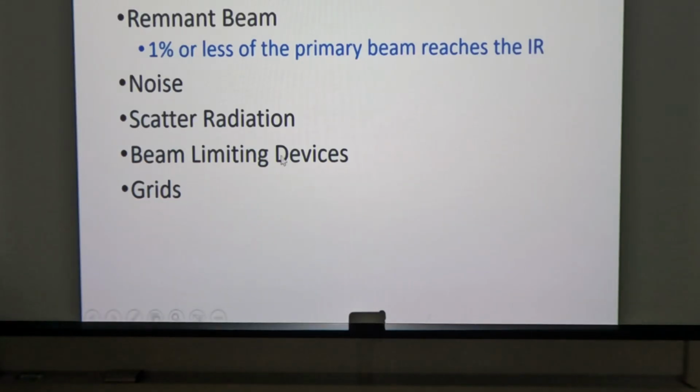Beam limiting devices are going to be, again, your collimators. We talked about two sets of collimators, one on top and one on bottom. The ones on top were specific for limiting off-focus radiation. The ones on bottom are the shutters that you actually see whenever you collimate, you open and close your collimation. Those are the ones that limit your light field and therefore limit your radiation field.